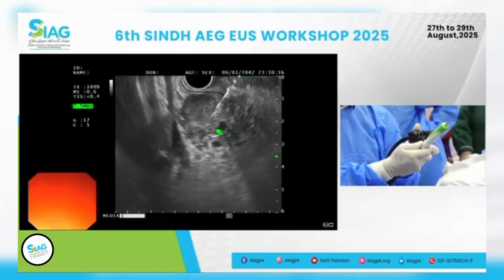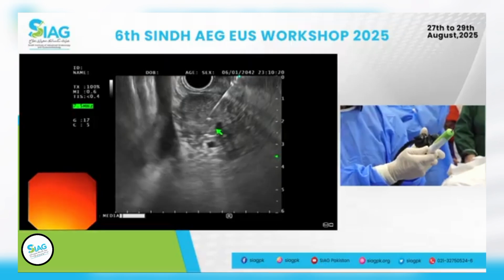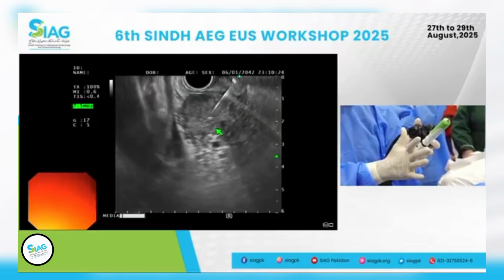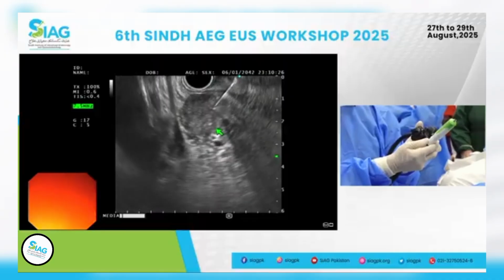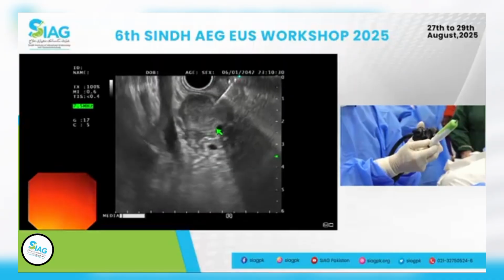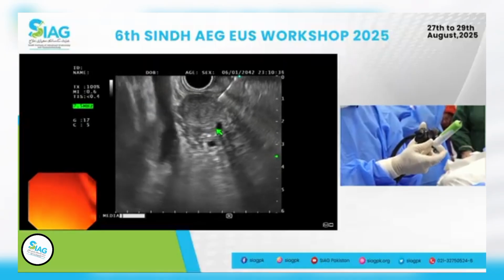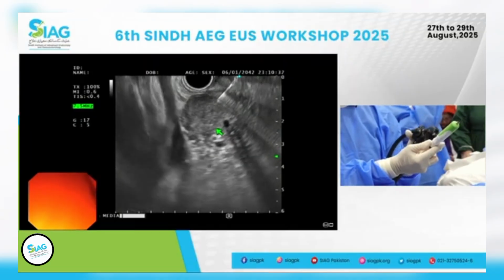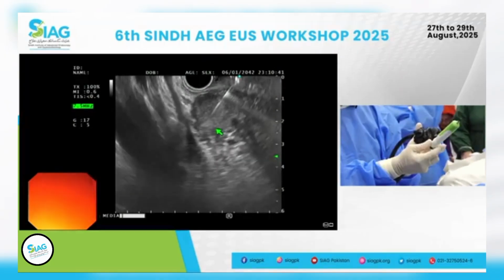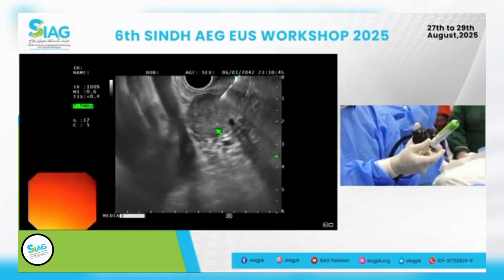You see that, how controlled that was? I wasn't looking at that, but I know how much it's going to go in, a couple of centimeters in there. So once that happens, with the FNB needle I'll go straight to the other end, pull it back. In one place, I don't go more than really 2 passes with the needle. That then just leaves a trail of blood in there. So I'll lift the wheel twice in that area, scanning.